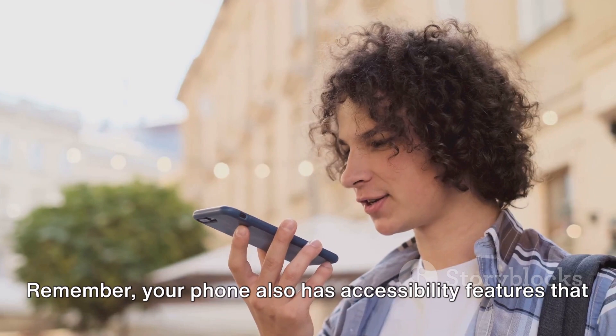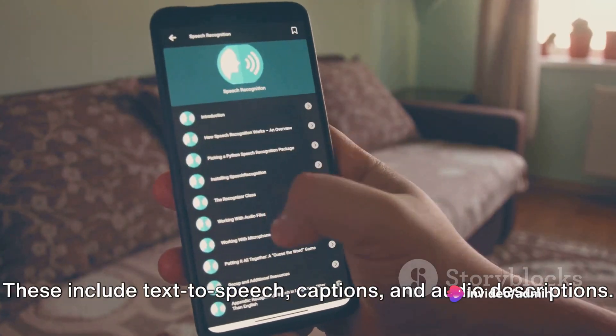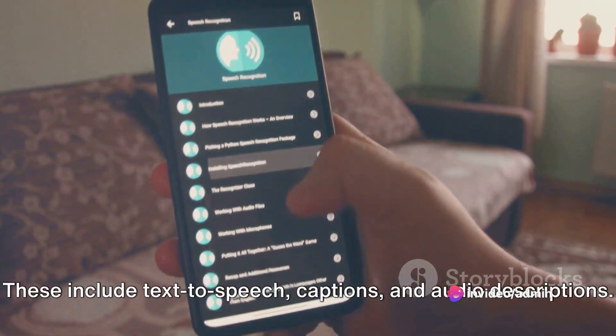Remember, your phone also has accessibility features that can enhance your hearing experience. These include text-to-speech, captions, and audio descriptions. Explore these features and see how they can benefit you.